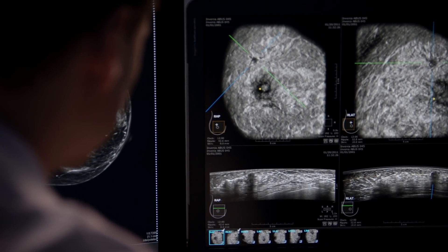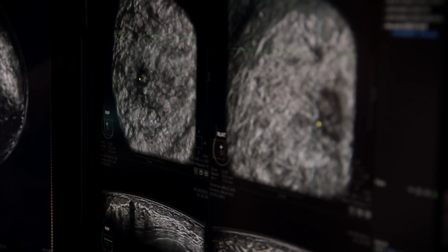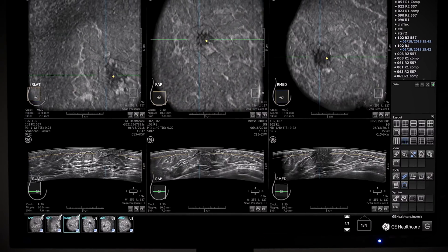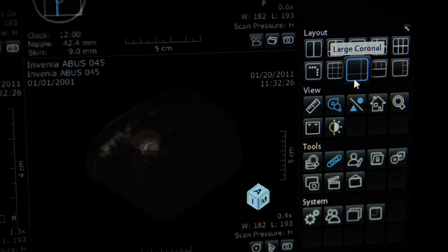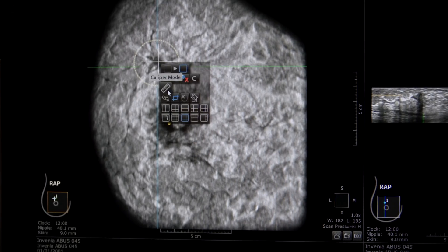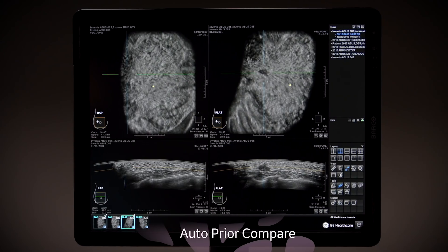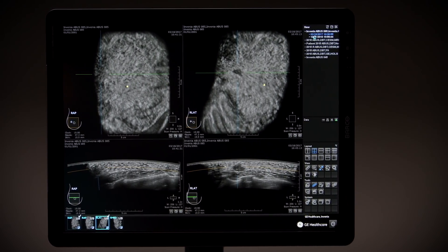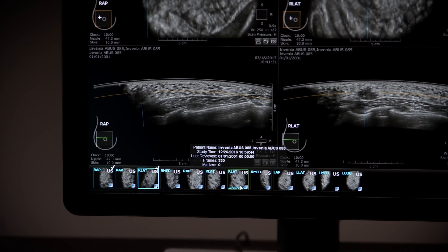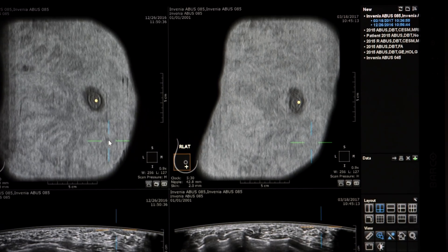The reconstructed 3D coronal slices allow for easy visualization of abnormalities on multiple views. Correlation with other projections and planes can be performed, and various hanging protocols, measurements, and image manipulation tools are available for thorough review and interpretation. The auto-prior compare feature mimics screening mammography workflow with the ability to save and compare priors for repeatable and reproducible longitudinal study comparisons.